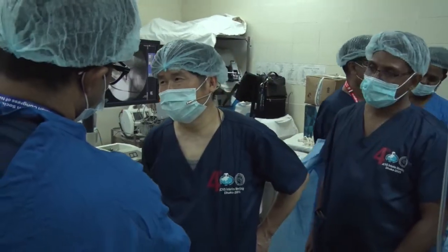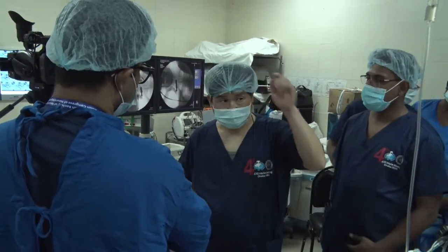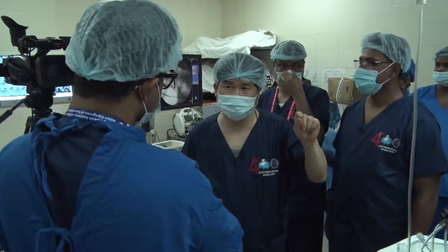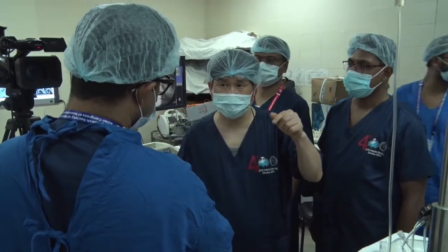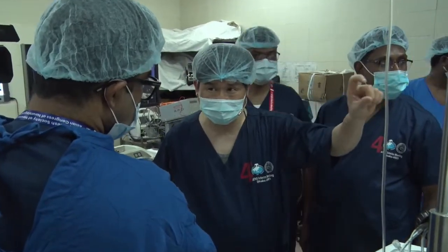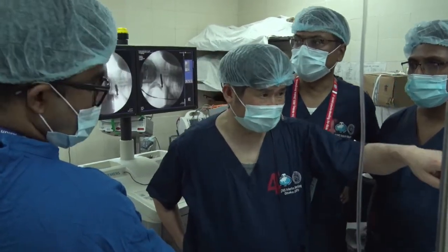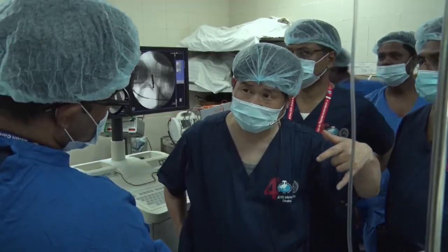Actually, the bleeding field is clearer than this usually. I think that maybe this patient has some bleeding tendency, meaning the vasculature is increased, causing some bleeding. But anyway, with the right setup of the blood fluid irrigation pressure and good RF coagulation setting, we can hear the coagulation sound.